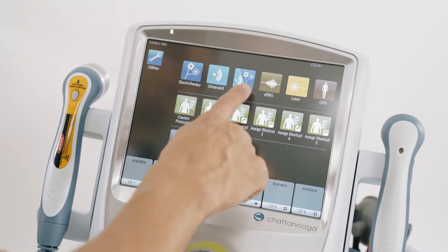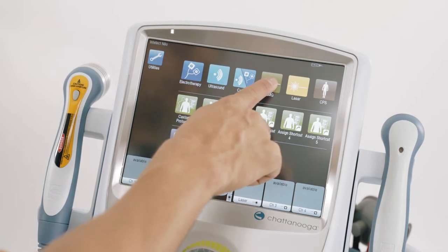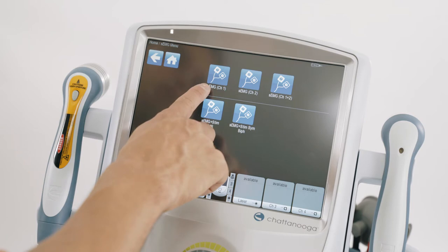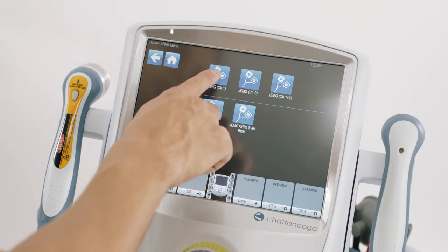To access the EMG, I can either go through the CPS or go directly into the SEMG modality on the home page. I have the option to choose channel 1, channel 2, or 2-channel EMG biofeedback. In this example I'm using channel 1.